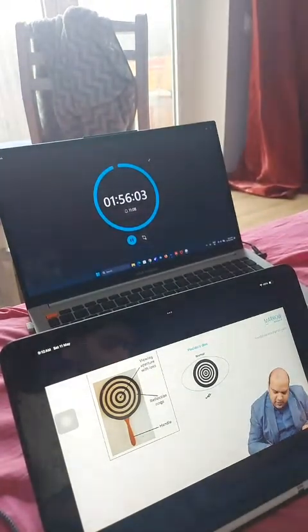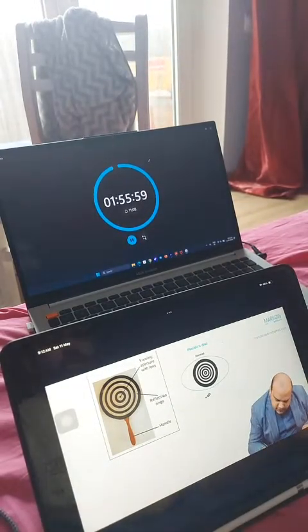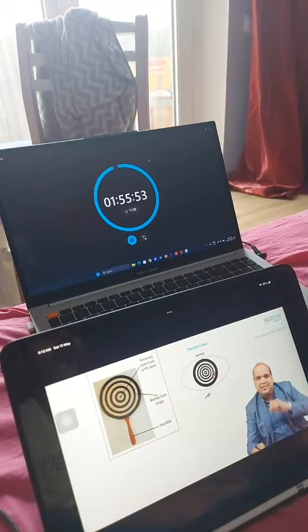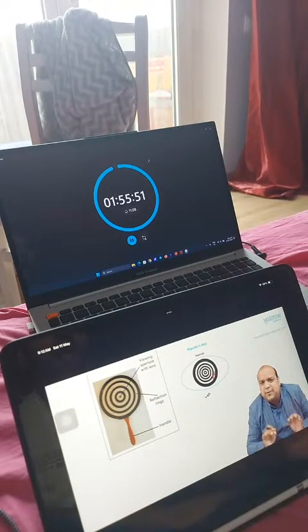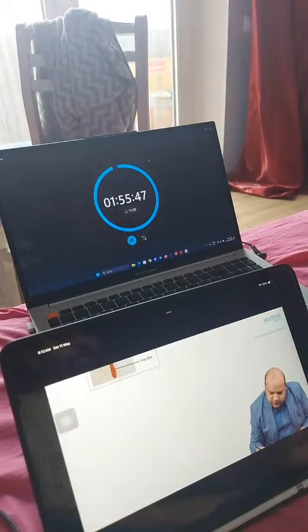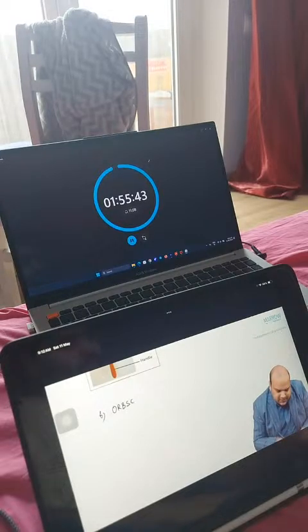As you will be able to see, all these rings seem equidistant and there does not seem to be any undulation. For example, if there was an undulation in this ring, then we would have known that there is an undulation in this part of the cornea, that there is an ulcer, there is some pathology in this part of the cornea. That is how simple placido disc topography is. But apart from placido disc topography, can we use other instruments? The answer is yes. The second instrument that we use is known as Orbscan.